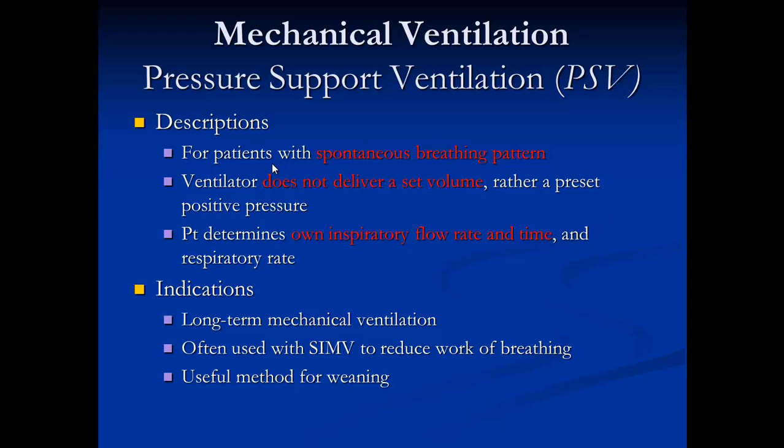So basically, this mode is for patients that are spontaneously breathing, because the ventilator does not deliver a set volume. Patients determine their own inspiratory flow rate and time, and indications are either an adjunct with SIMV to reduce the work of breathing, or patients that are in long-term mechanical ventilation.